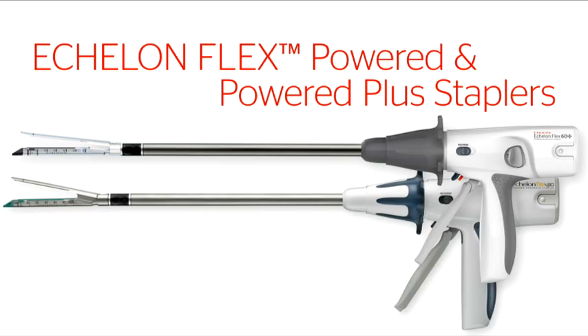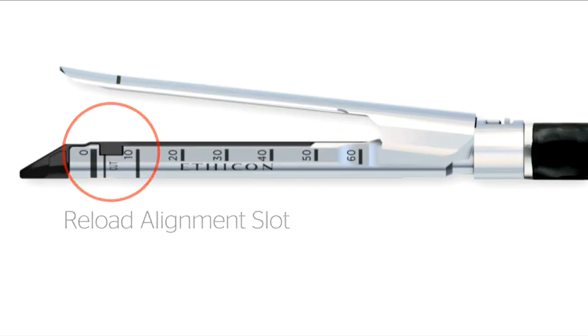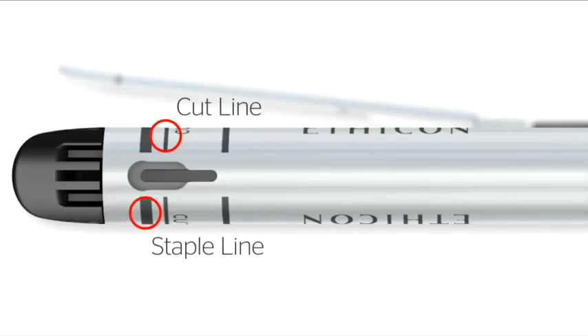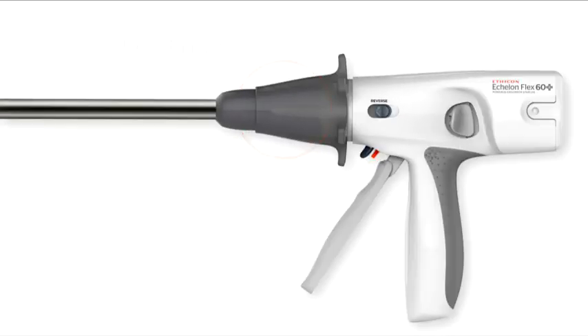Nomenclature. Anvil jaw, Reload Alignment Slot, Cartridge jaw, Cutline, Staple Line, Knife Blade Indicator, Rotating Knob, Articulation Fins.